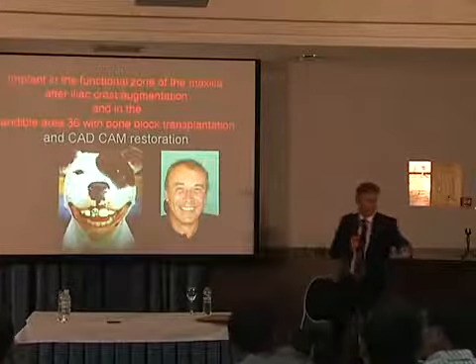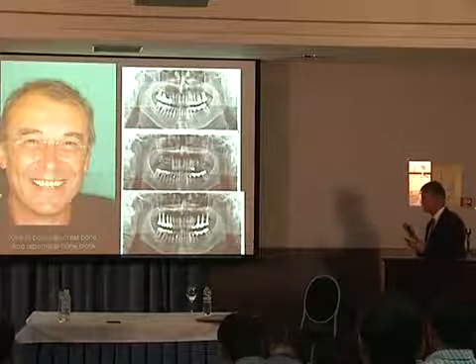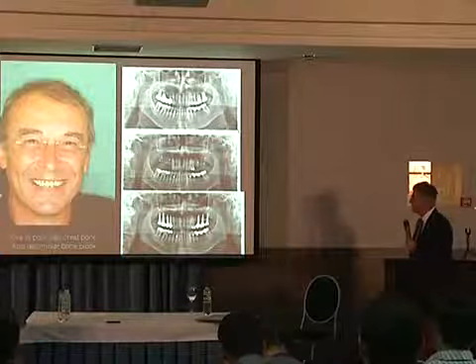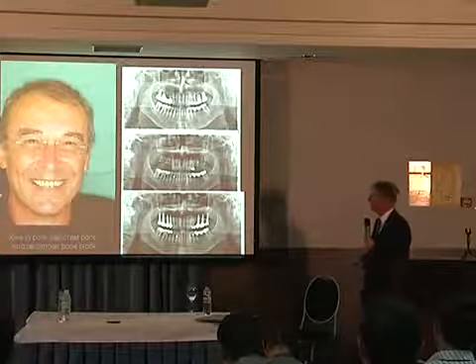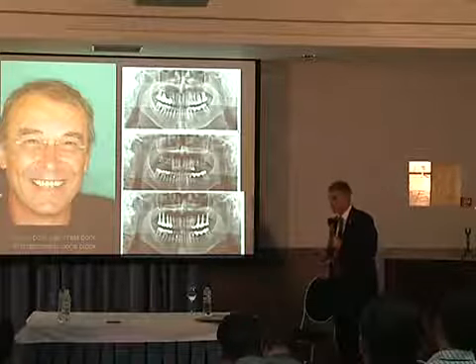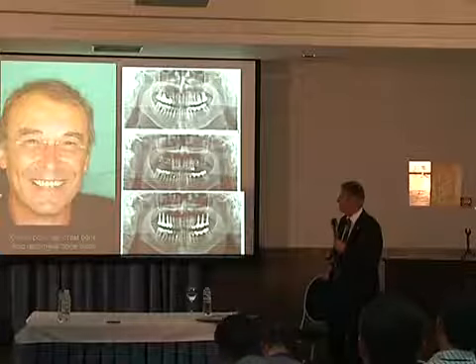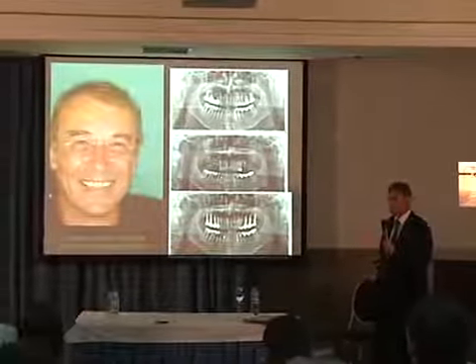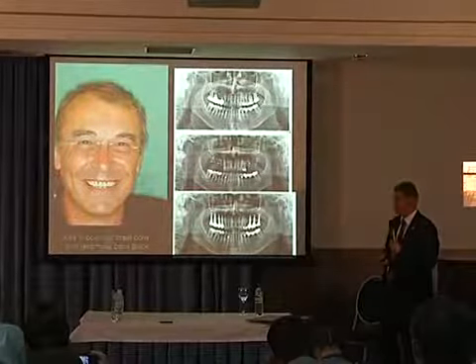У данного пациента, он уже говорил, был блок подсажен на верхней челюсти, были поставлены имплантаты. На нижней челюсти у него был мостовидный протез. Мостовидный протез сломался. Когда пациент обратился к доктору Бергману, он предложил ему сделать новый, потому что там был дефицит костной ткани. И он ему предложил: надо будет блоки ставить сюда, иначе сделаем новый мостовидный протез. Пациент сказал нет. Я хочу опять имплантаты.